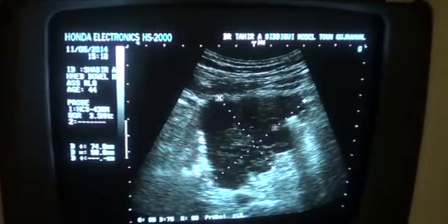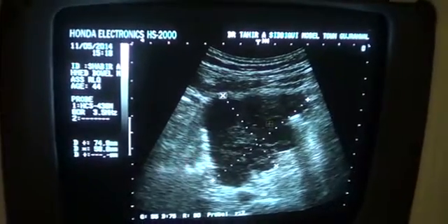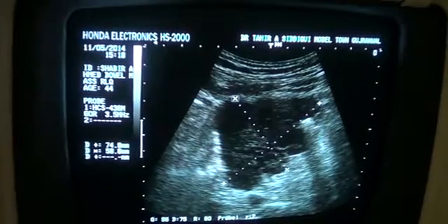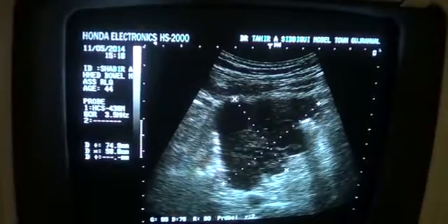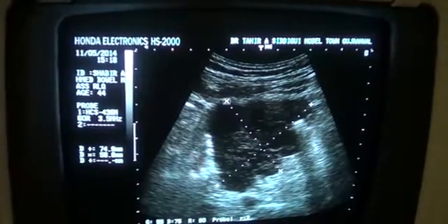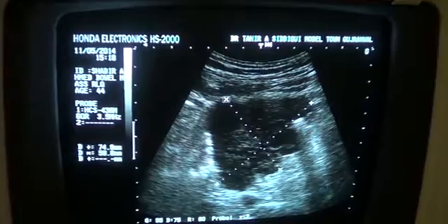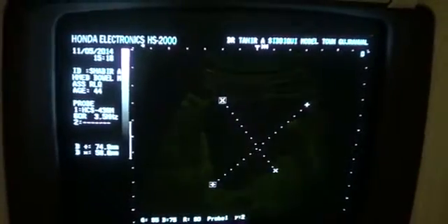Therefore this is the fluid compartment of the bowel mass, and this is the air giving dirty shadow. This is a bowel or a segment of the bowel which is giving dirty shadow, and this measures 7.4 by 5.8 in this dimension.